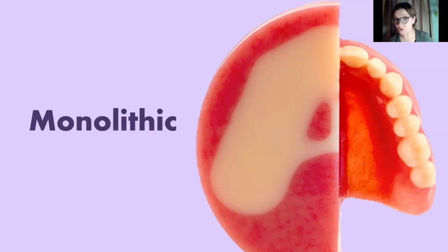So what that means is there's no separate denture teeth. So you won't have denture teeth debond, which is the most common error we see with complete dentures, or the most common post-op complication, denture teeth debonding. Here, there's no teeth to debond.